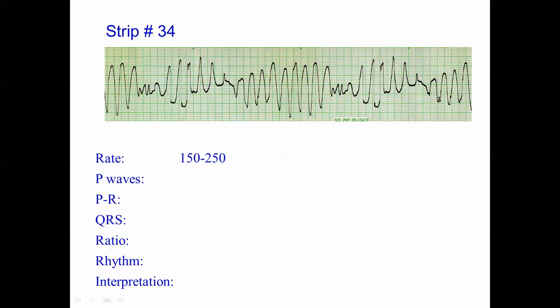The P waves: this is an absolutely chaotic rhythm and the P waves will be absent. Because the P waves are absent, the PR interval is not applicable. The QRS is wide and the QRS deflection varies.